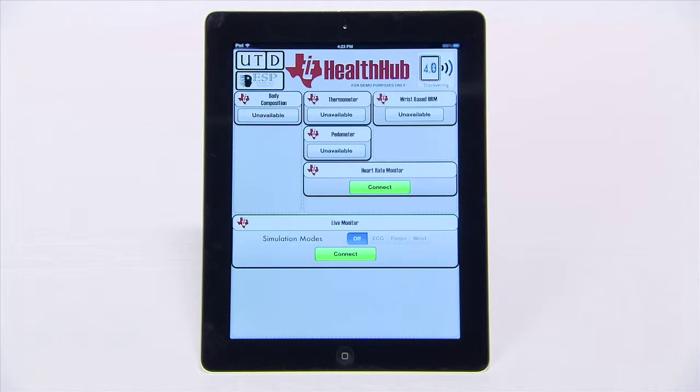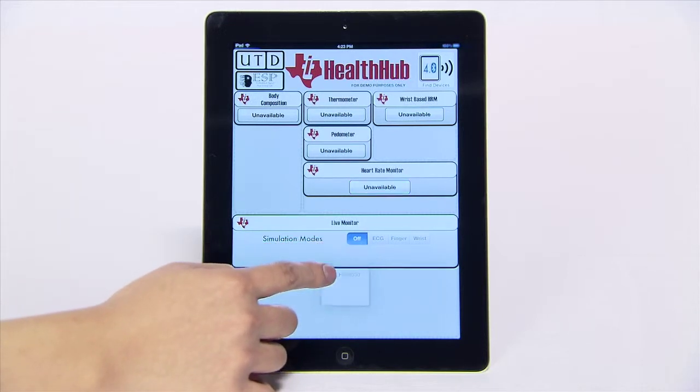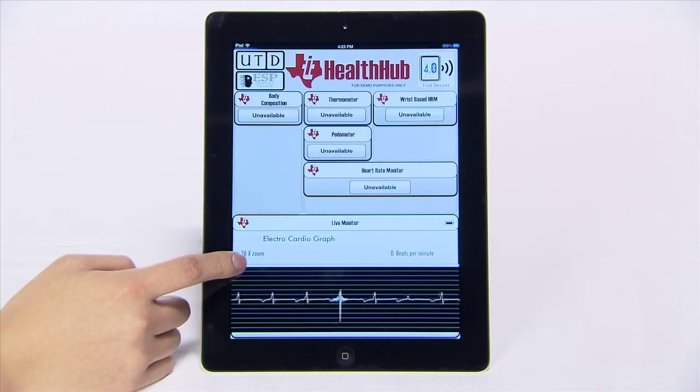The heart rate monitor tile will display heart rate values only. The live monitor tile will provide the same information and also show the ECG waveform in real time. We can now see the streaming of live ECG data in the graph and heart rate values in the dedicated text box. You can use a slider to change the zoom on the graph.